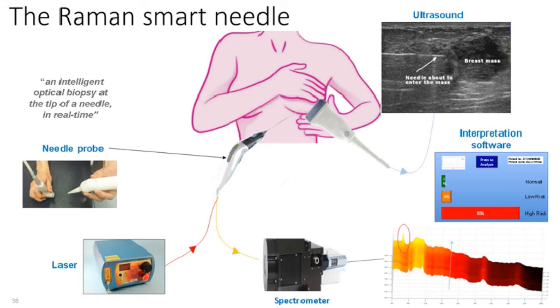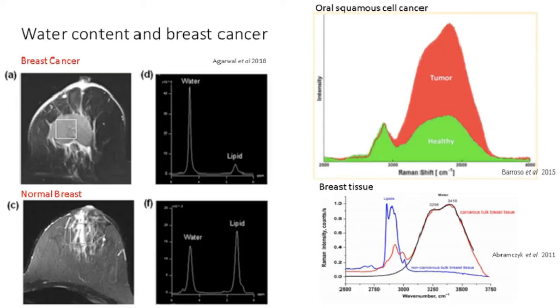We're looking at how we might be able to modify that for its use beyond the head and neck into potentially all sorts of areas of the body. In this example, we've had a test phantom where we're measuring spectra as we insert the needle into the sample at the bottom right. Within the red ellipse, you'll see that little peak is representing hydroxyapatite. So we've been able to see some calcification material that is buried within that phantom breast that we're using. And this could be very useful.